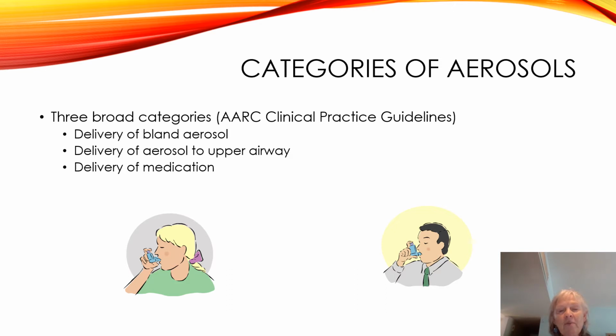And if you look at the bottom there, you see two pictures of people doing aerosols. And if you notice, they're doing metered dose inhalers, and they're putting the metered dose inhaler in their mouth to be able to take this medication.